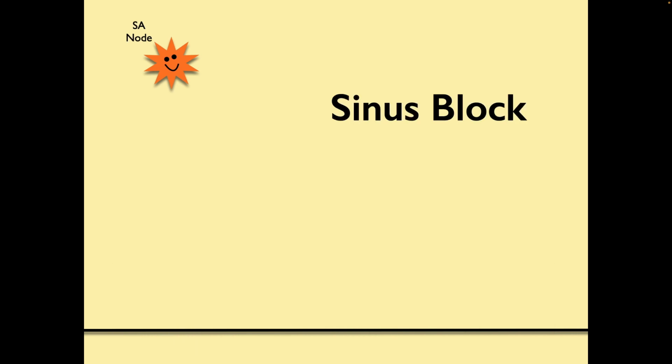We're now going to have a sinus block, okay? So the SA node does its job 2 times, and then if you watch, it's still doing its job, but the gate's closed, and then the gate opens, and then we're back, okay?